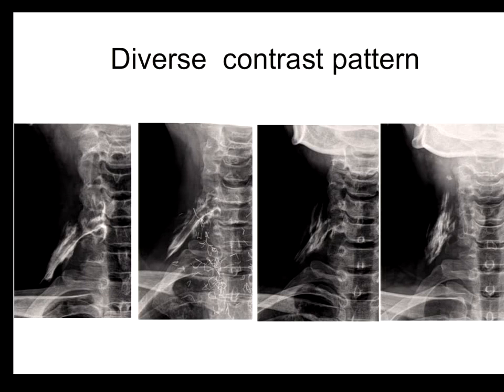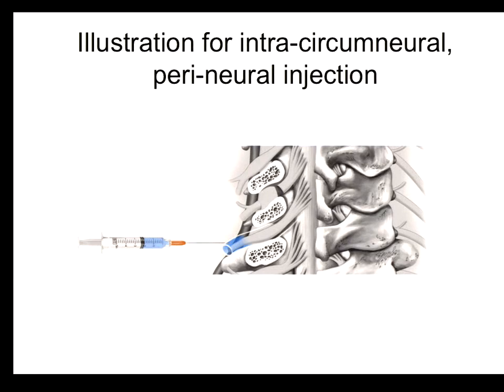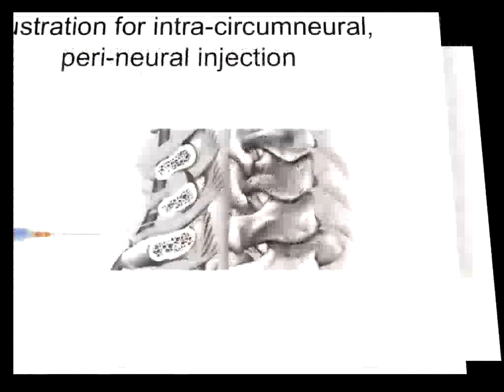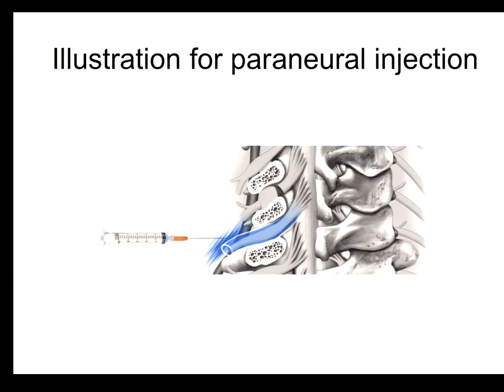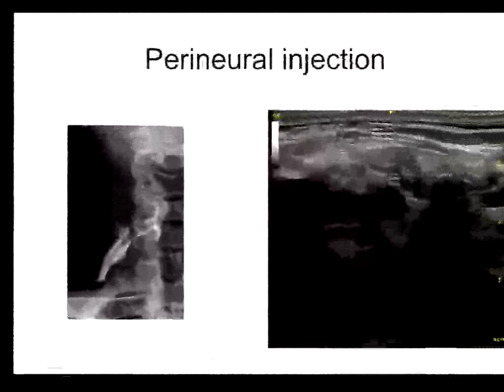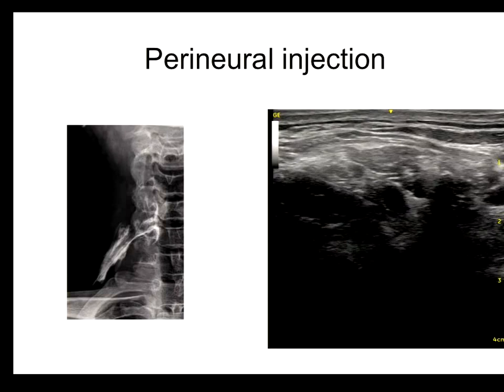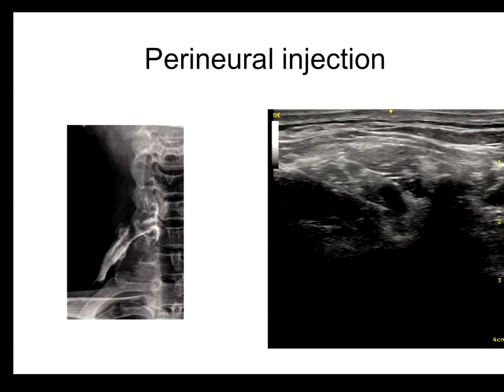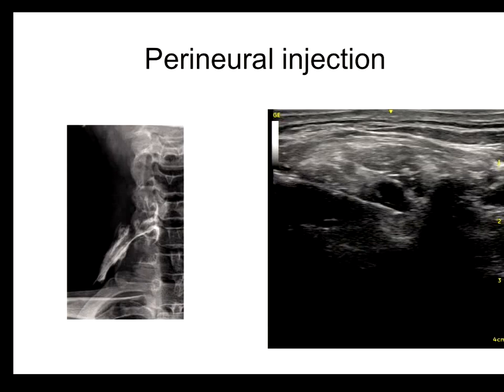You can get very diverse contrast patterns after ultrasound-guided injection, ranging from optimal to intramuscular injection — the latter being a failure. For an intra-circumneural or perineural injection, if you place the needle inside the circumneural sheath you get the optimal image. For a paraneural injection, if the needle tip is at the wall of the circumneural sheath, some injectate goes perineural and some leaks into the intramuscular layer. This is a demonstration: you can see the well-defined hypoechoic nerve root, place the needle behind it, and identify the circumneural or intra-circumneural space.